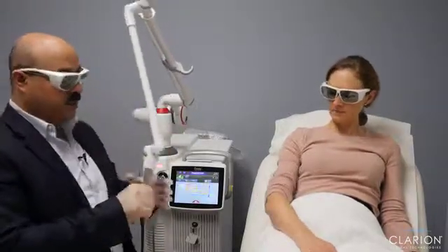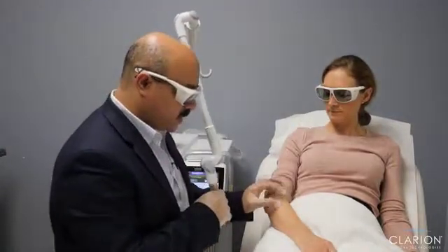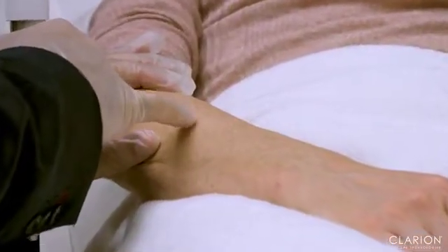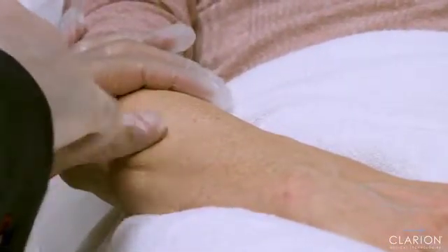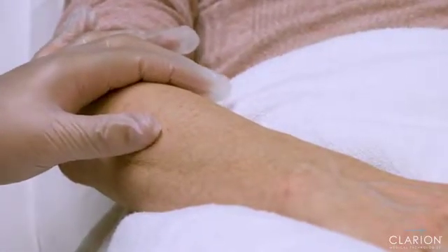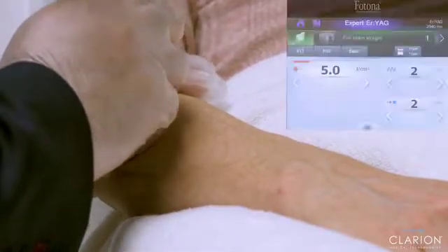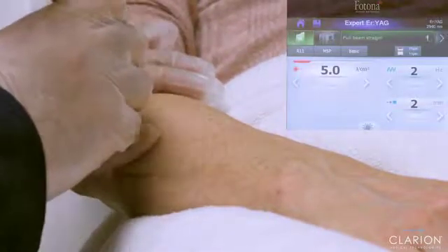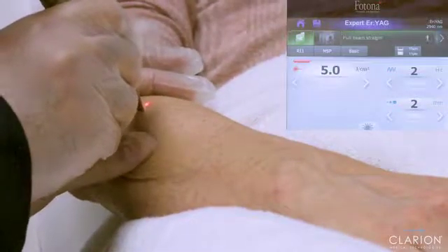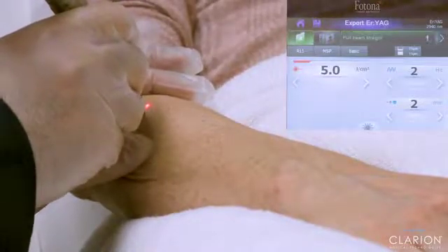And now we are going to be removing this brown spot. I don't know if this is clear to the camera or no. I'm going to remove this brown spot and then this one, and show you how it's easy to remove it in few seconds and with almost no pain. Courtney is a little bit worried of the pain. We are going to hear a loud sound, but that's it. So this is the sound, and I think you are feeling nothing. Yeah, that's not bad yet. Yet.